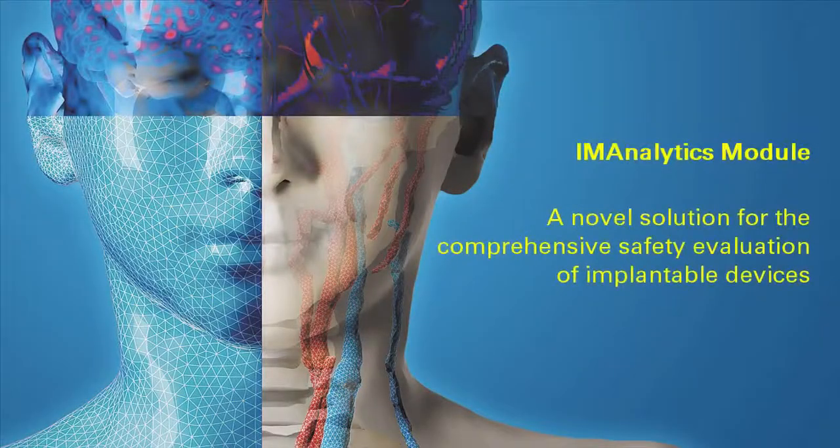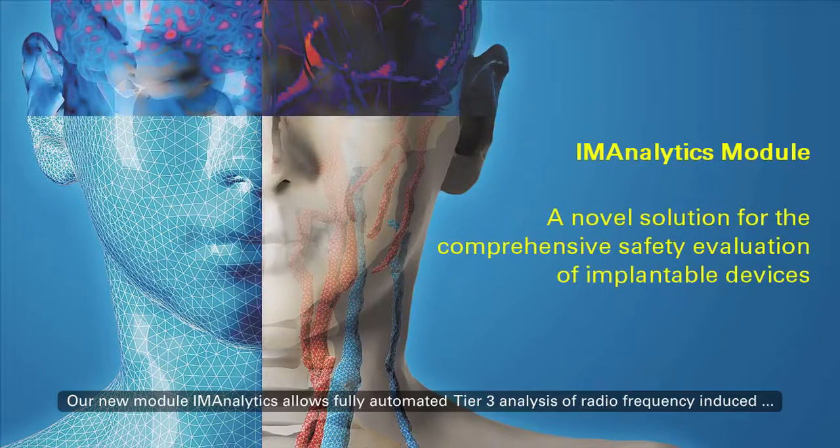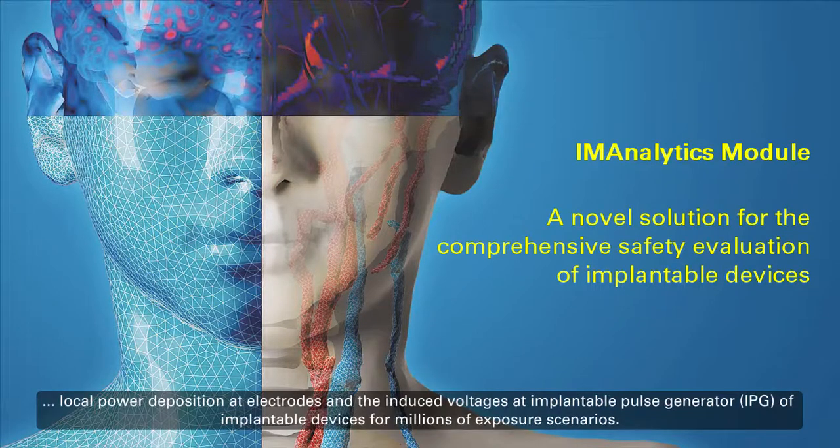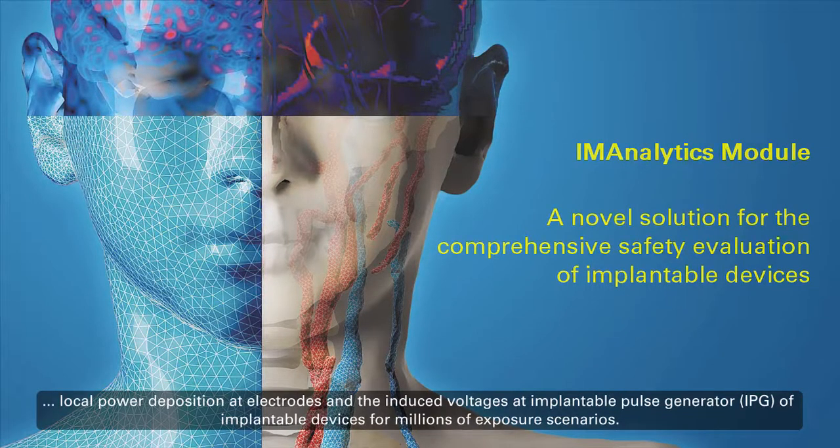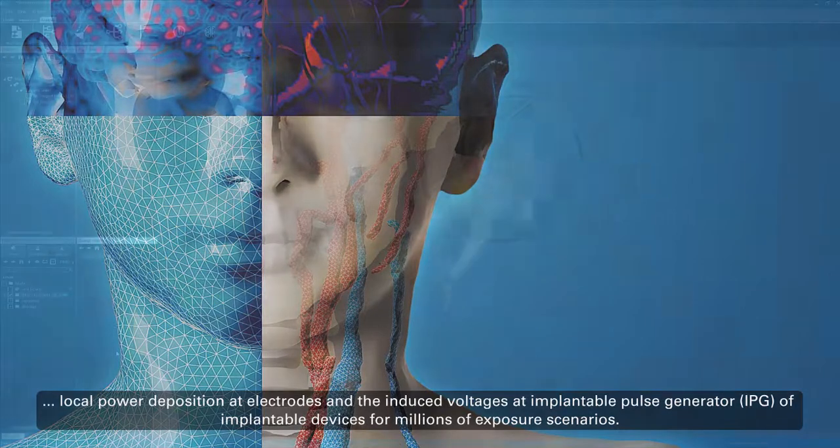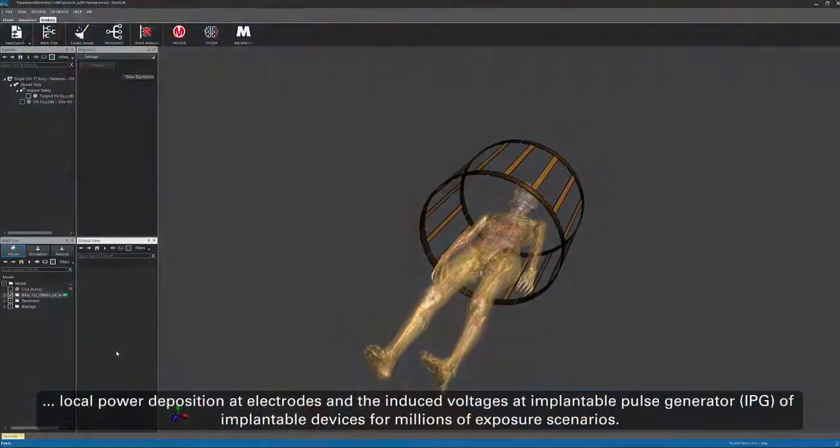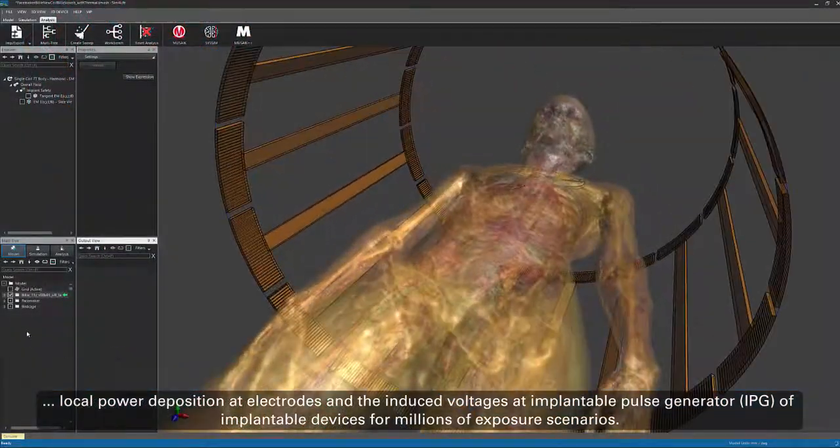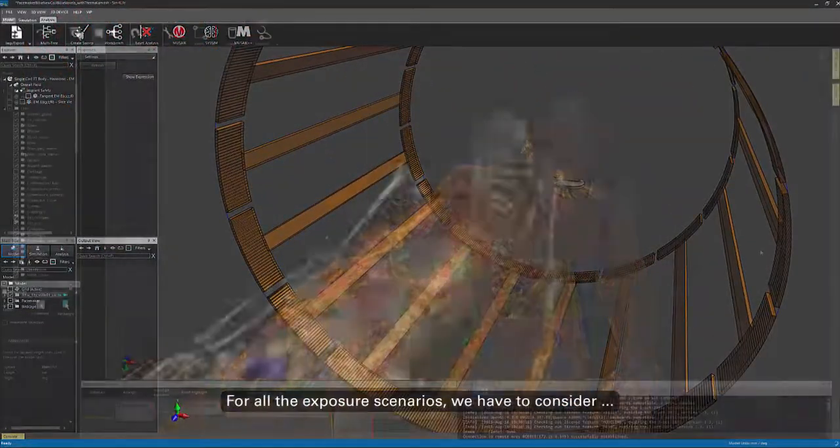Our new module, IM Analytics, allows fully automated Tier 3 analysis of radio frequency induced local power deposition at electrodes and induced voltages at IPG of implantable devices for millions of exposure scenarios.